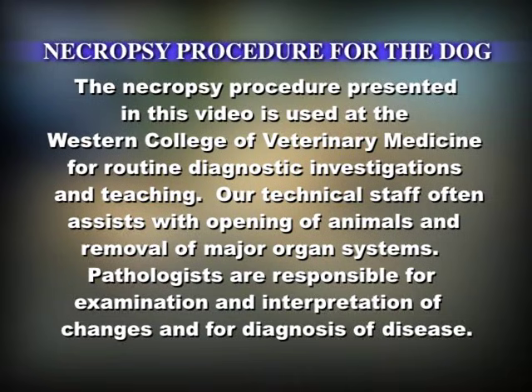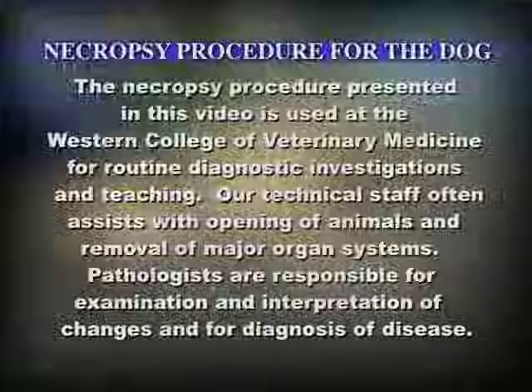The necropsy procedure presented in this video is used at the Western College of Veterinary Medicine for routine diagnostic investigations and teaching. Our technical staff often assists with opening of animals and removal of major organ systems. Pathologists are responsible for examination and interpretation of changes and for diagnosis of disease.